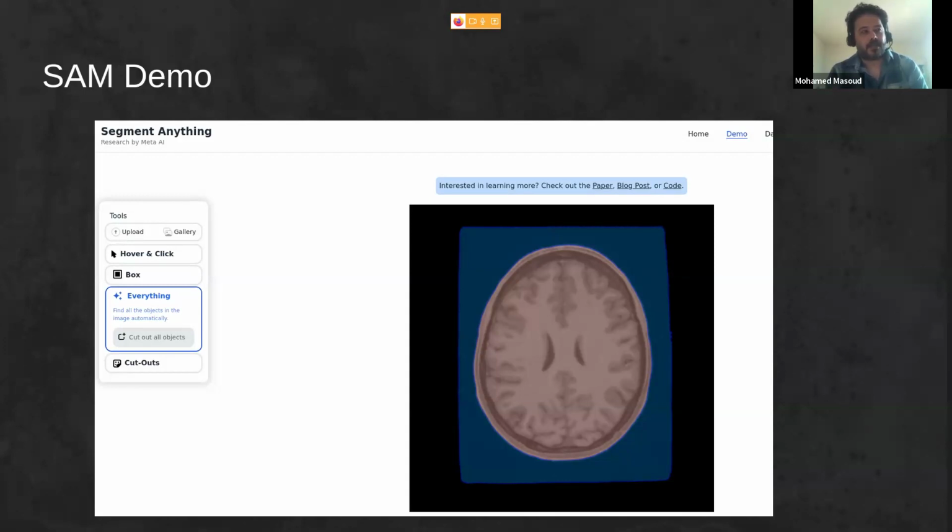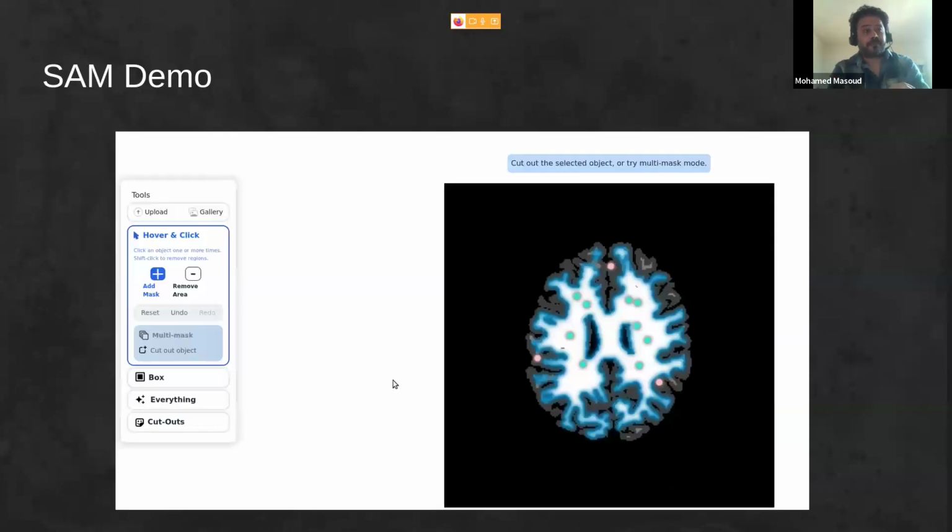It's like a masking actually for everything, without specifically finding gray matter or white matter regions. Even when I tried, just as a test, I put the label itself. So the label here distinguishes between the gray matter and white matter.